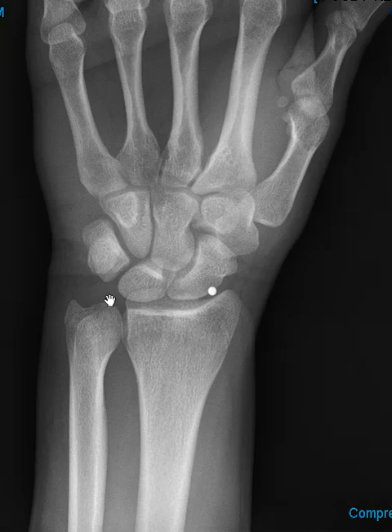We'll put fluid into the proximal joint, then send the patient to the MRI machine. The contrast will show up as bright on the MRI scan. If the contrast extravasates into the mid-carpal compartment, we would suspect a tear of a ligament — maybe the scapholunate ligament between the scaphoid and lunate bones. We can also see a tear of the triangular fibrocartilage: if contrast extravasates down through it into the distal radial ulnar joint, we know they may have a tear of their TFCC.